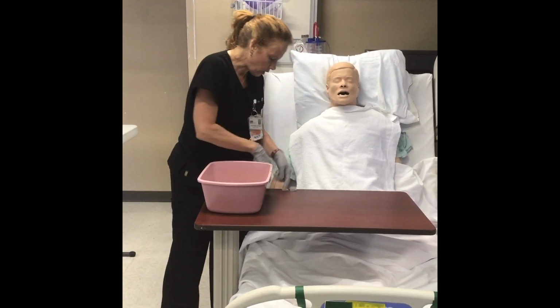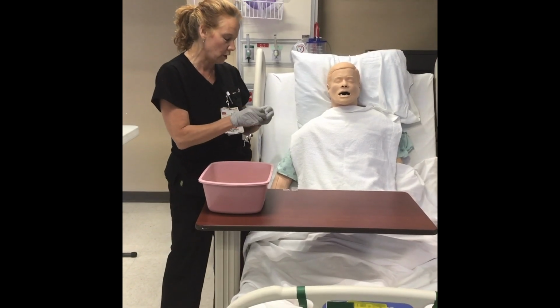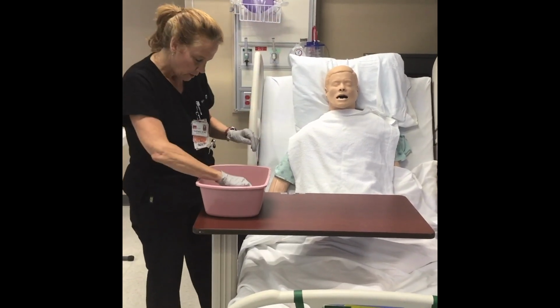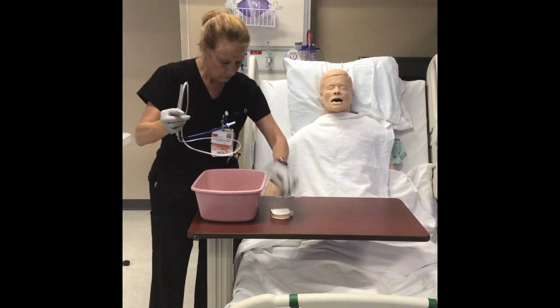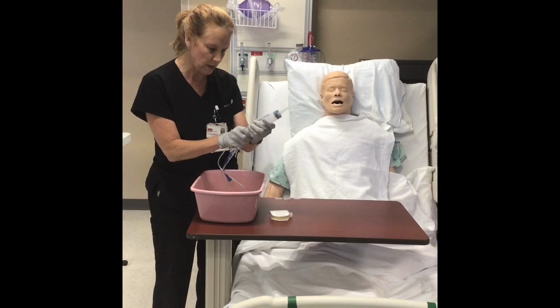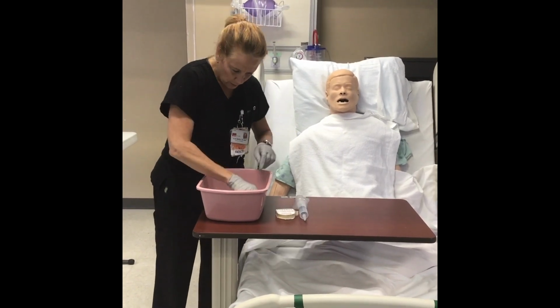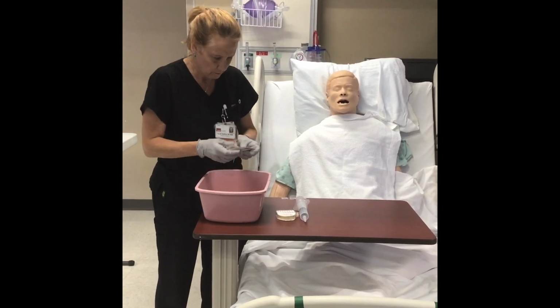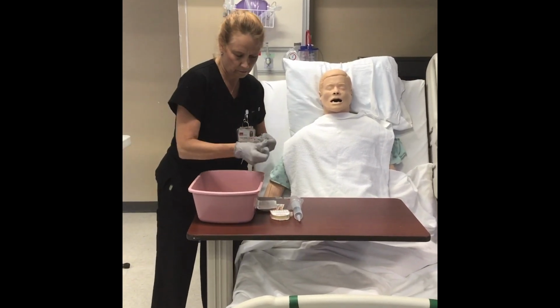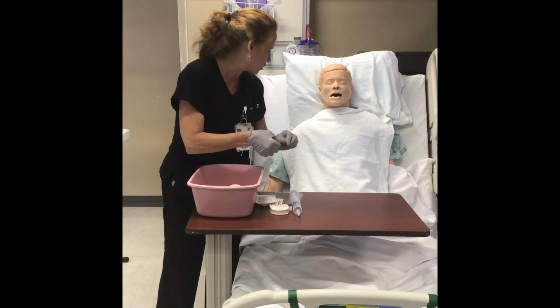So I'm taking one piece of tape that's going to secure to your cheek. I'm making another piece of tape that we're calling the blue jeans, which is going to secure to your nose. And then I'm making another piece of tape to act as my marker on the NG tube. Okay. I'm going to pull back on my syringe here because I need to aspirate your stomach contents once I insert the tube. And we're going to go back between 20 and 30 milliliters. And then this is the safety pin mechanism to secure the tube once it's in place.